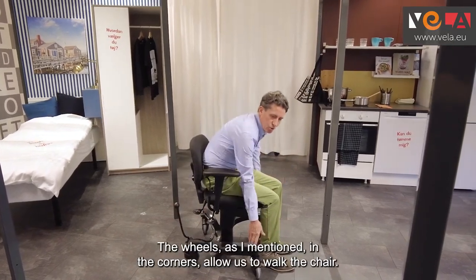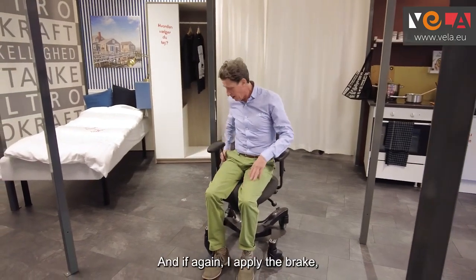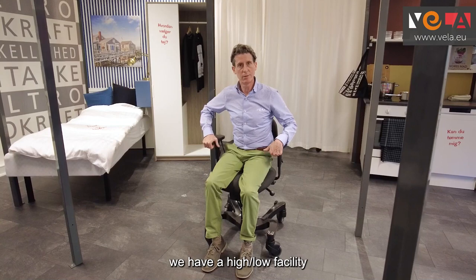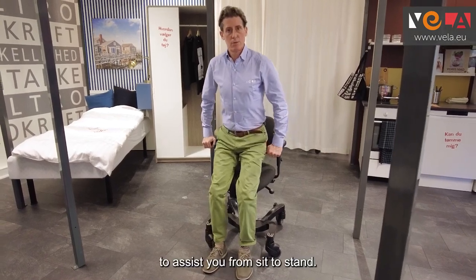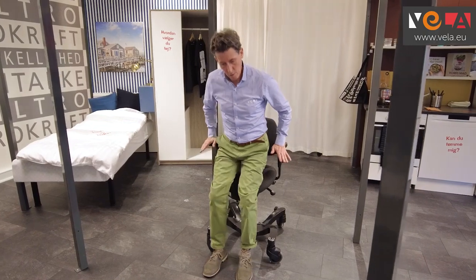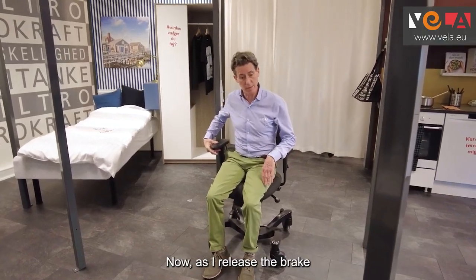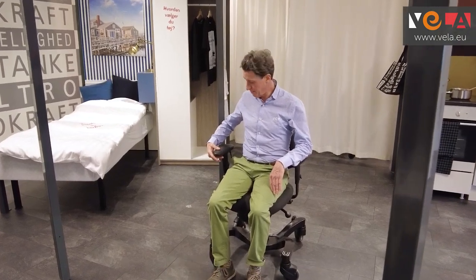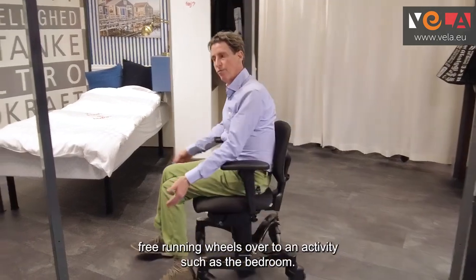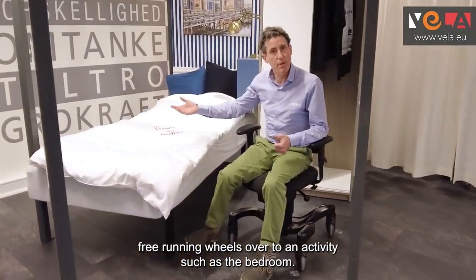The wheels, as I mentioned in the corners, allow us to walk the chair, and if I apply the brake we have a high-low facility to assist from the sit to stand, and getting in the chair nice and gently I can then lower myself down. As I release the brake I can walk the chair on the free running wheels over to an activity such as the bedroom.